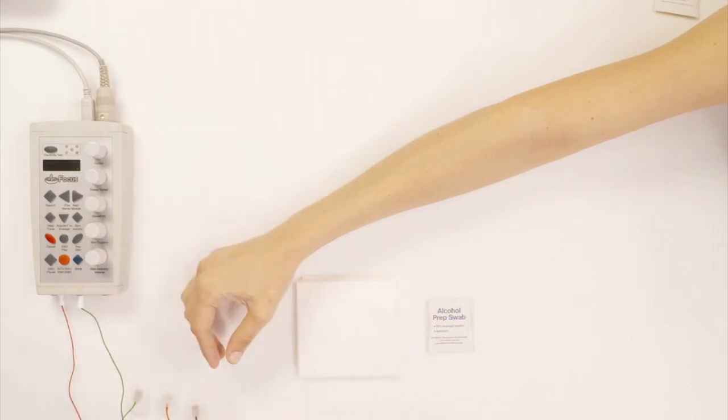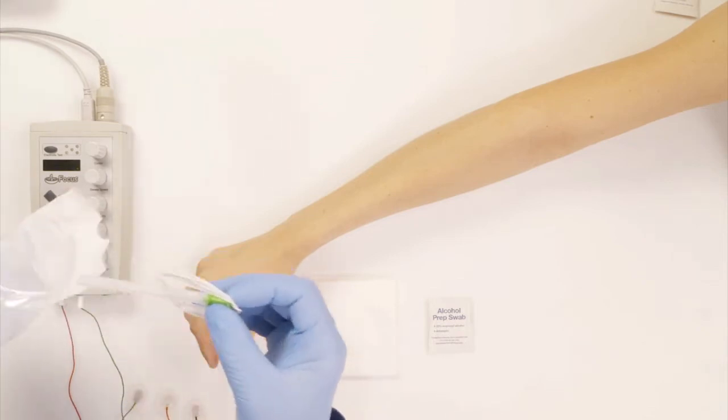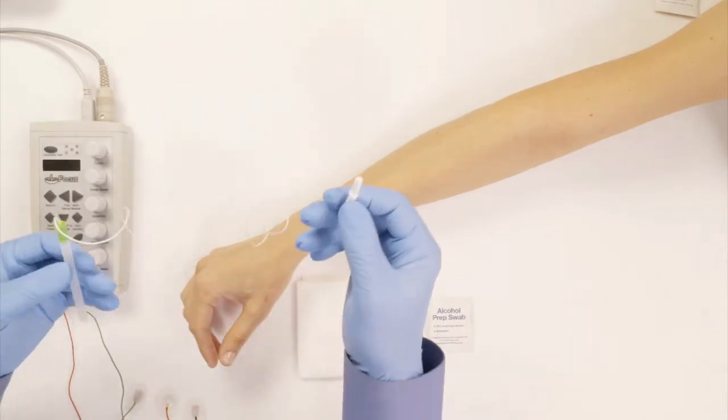And the black electrode that we use for the nerve conduction now is going to be replaced by the needle. And here's the needle. First, I'm going to open the needle. That's a sterile needle. It's one use only. And the needle is like so.